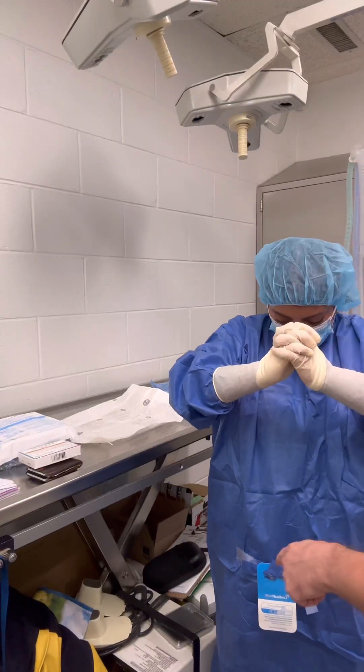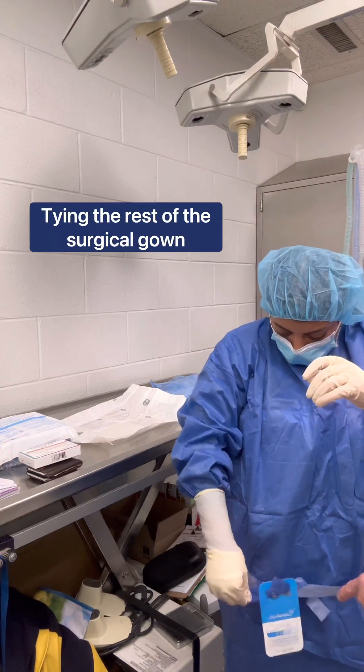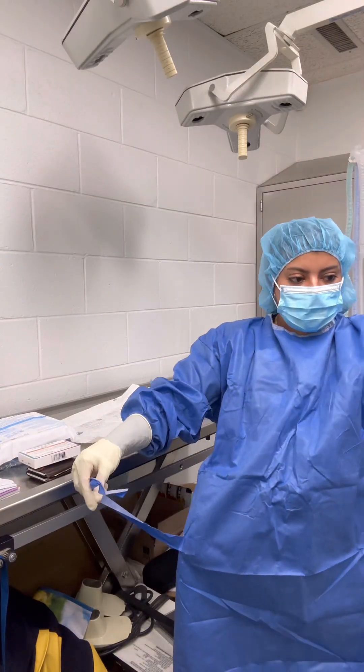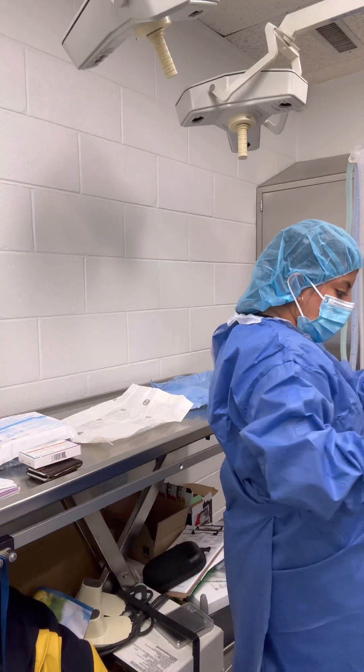With your left hand, grip your gown, and with your right hand, hand me that blue tag. Hand it to me. Now grab that. Now twirl. Now take that string off, and you tie that, because now you're sterile.